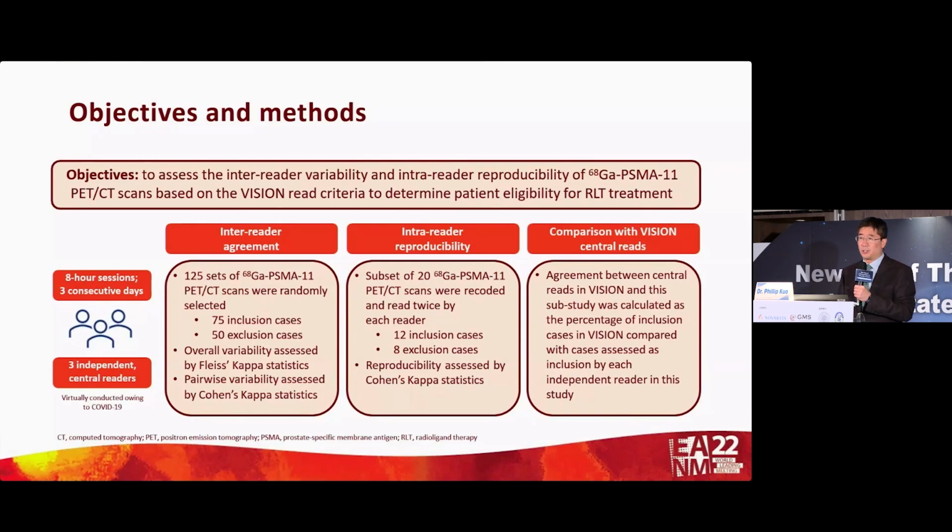We planned this like we typically did prior to COVID, where we would fly the readers in, I would train them, and they would read them on site. But then COVID happened, so we had to do all these remotely, and I never used a Zoom breakout conference meeting before. It all took a lot longer than it should have. And again, these 3 readers had never read a PSMA PET scan before in their life. I had to train them how to read PSMA PET and then how to read these criteria specifically.